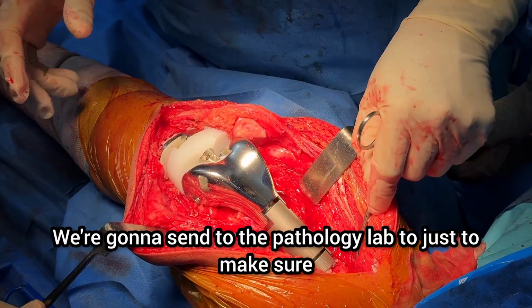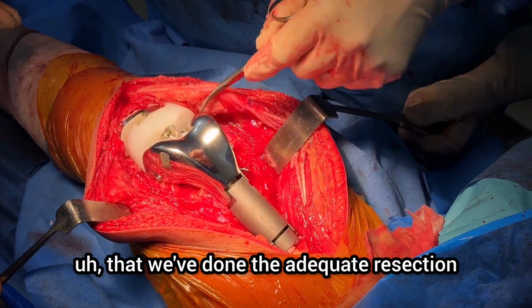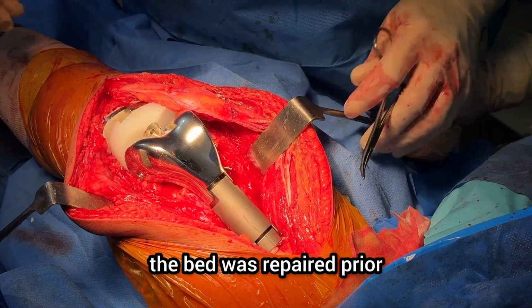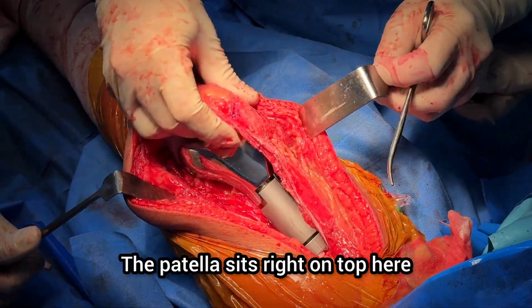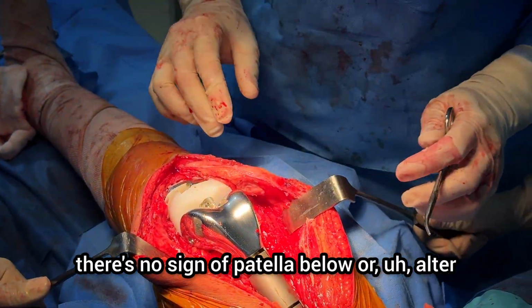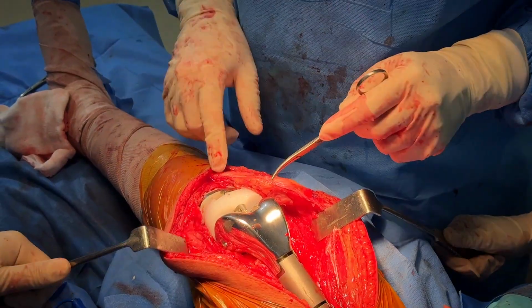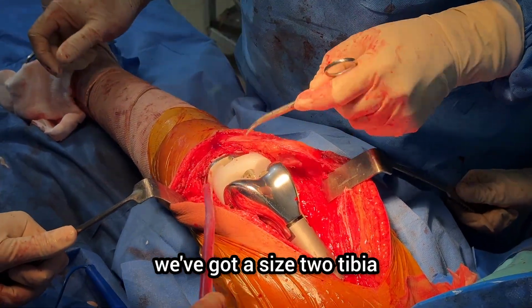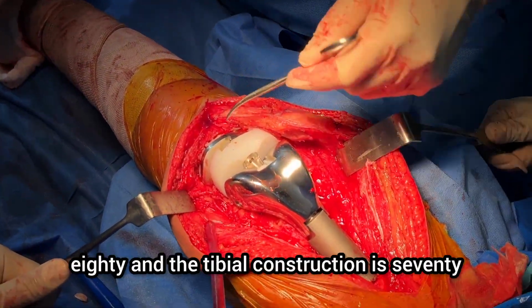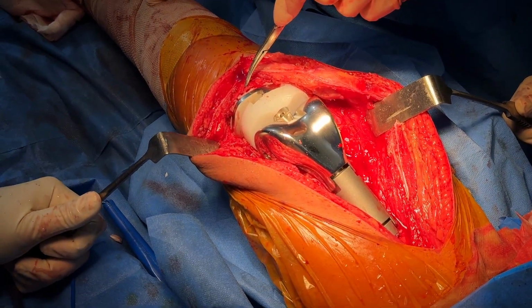We're going to send it to the pathology lab just to make sure that we've done an adequate resection. You can see the bed was repaired prior, as I showed you. The patella sits right on top here, so I'm very pleased with that. There's no sign of patella baja or alta. We've got a size 14 poly now. Moving to the tibia, we've got a size 2 tibia. We've got a stem of 80 and the tibial component is 70, so 150 to here.